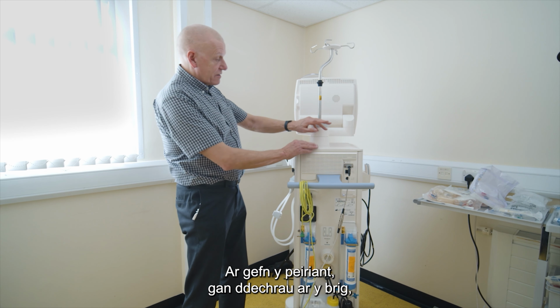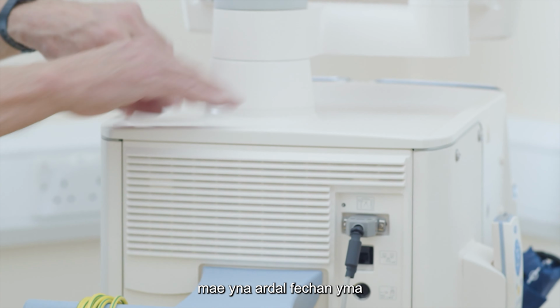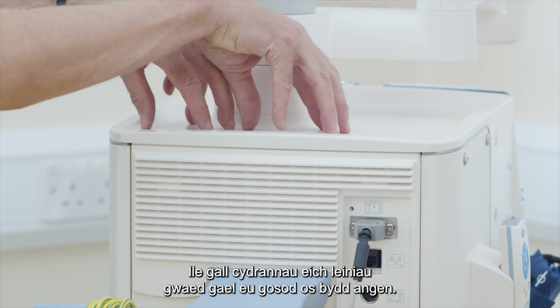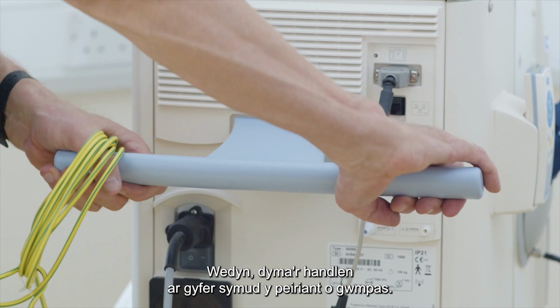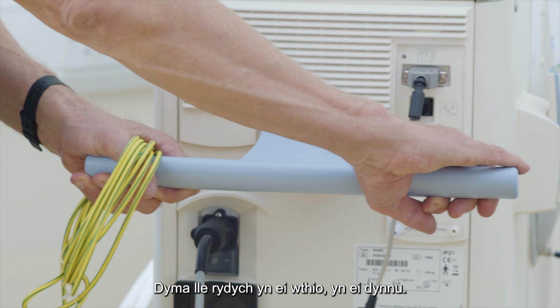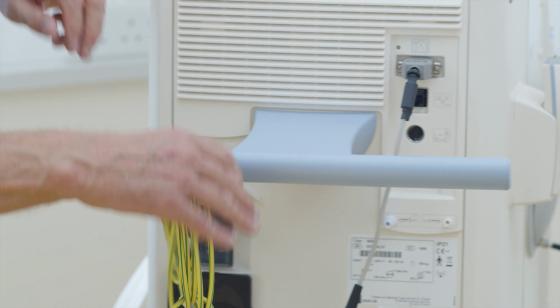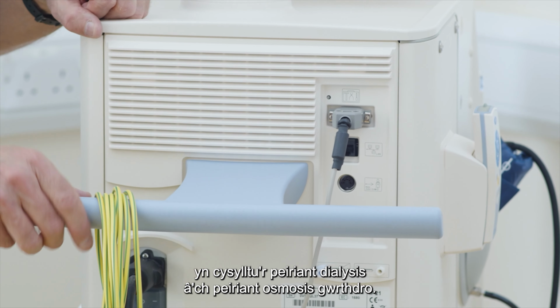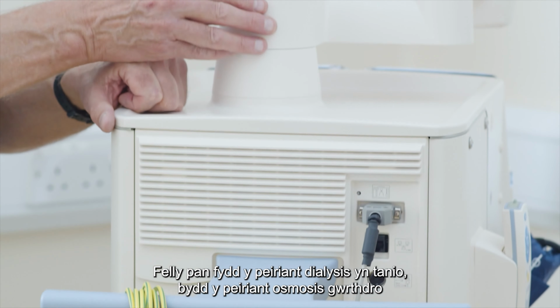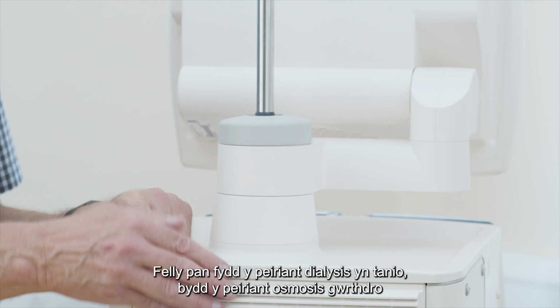Back of the machine, starting at the top, you have a small area here where certain components, your bloodline components, can sit if need be. You then have the handle for moving the machine around. This is where you push it and pull it. This connector here connects the dialysis machine to your reverse osmosis machine, so when the dialysis machine switches on, it'll switch the RO machine on at the same time.